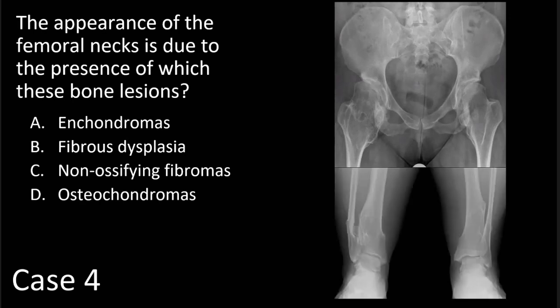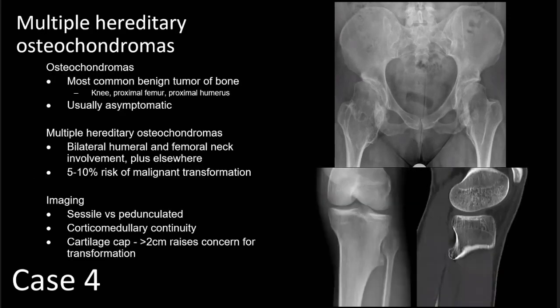To help answer this question, here is an AP standing view of both ankles showing the same pathology involving the distal tibial and fibular metaphyses bilaterally. The answer is osteochondromas, and this is a pathognomonic appearance for multiple hereditary osteochondromas. Osteochondromas are the most common benign tumor of bone, representing about 30% of benign bone tumors, with giant cell tumor being second at around 20%. Most osteochondromas occur around the knee. When patients have multiple hereditary osteochondromas, they have this pathognomonic appearance of sessile osteochondromas involving the femoral necks, with that widened femoral neck appearance and loss of normal waisting. A very similar appearance can occur in the proximal humeri as well.